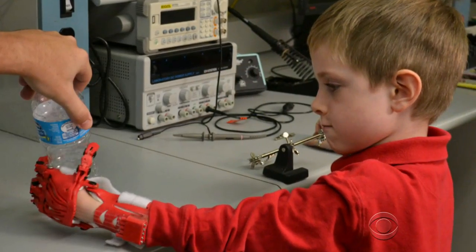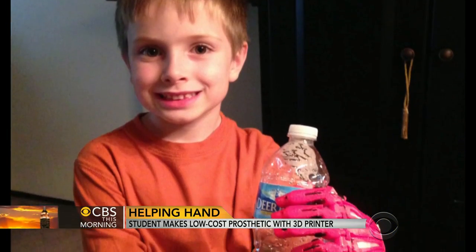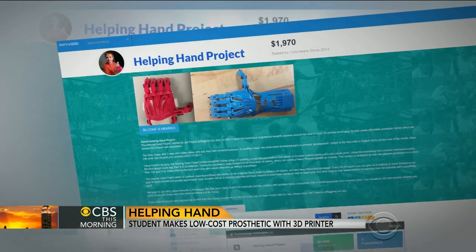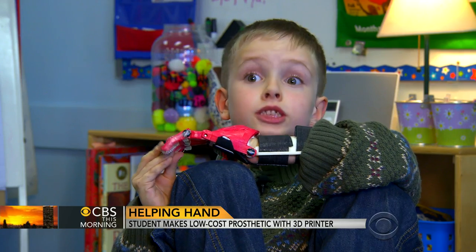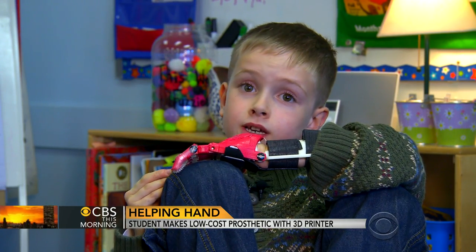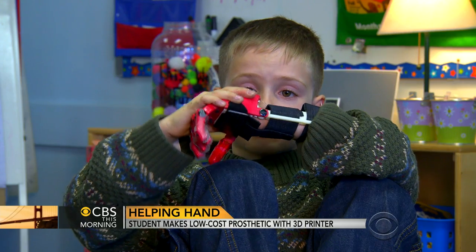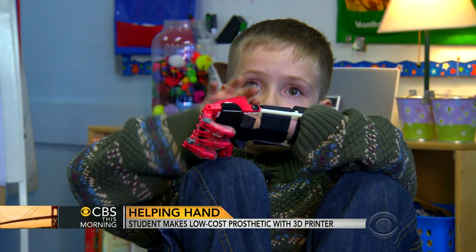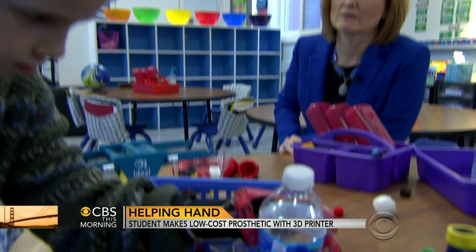And the payoff for this amateur designer? When he picked up a cup, you were able to say to yourself, hey, this works. Yes. That had to be a great moment. It's nice to see it all pay off. Powell has now started a crowdfunding campaign to raise money so other kids can get the device too. I'm actually really happy because once I get the best hand, they'll make more like it for those kids, and then they'll have the best kind of hand too. 11 more children are already waiting for their new hands.